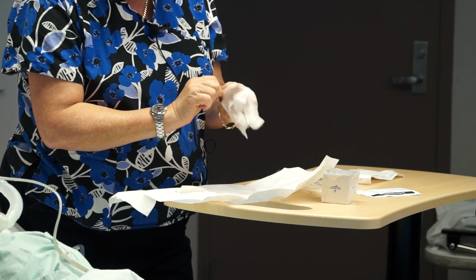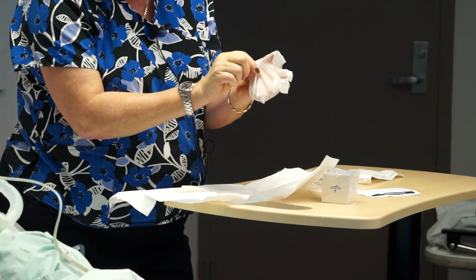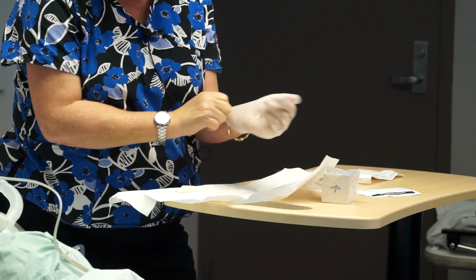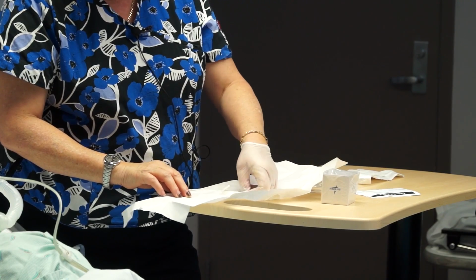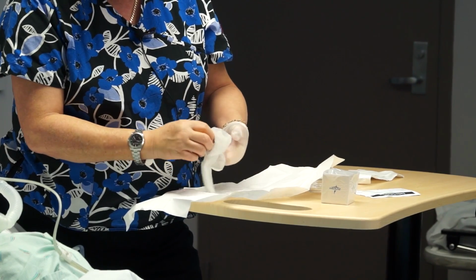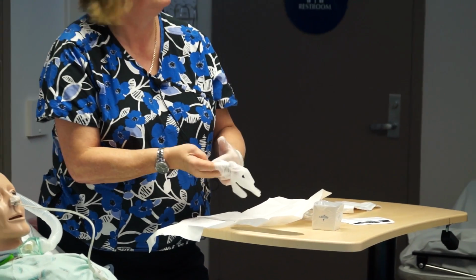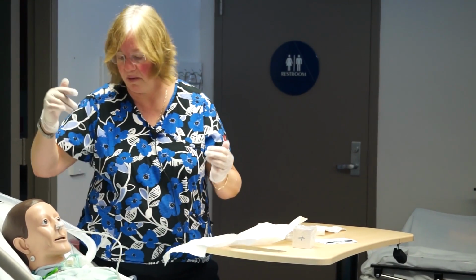The other thing I would have done is turn on my suction over here, because once I put on these gloves, I'm not going to want to touch anything over there. You put them on 100, 120? About 120. We can put them on 120.